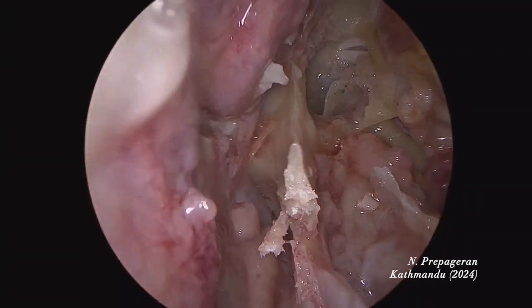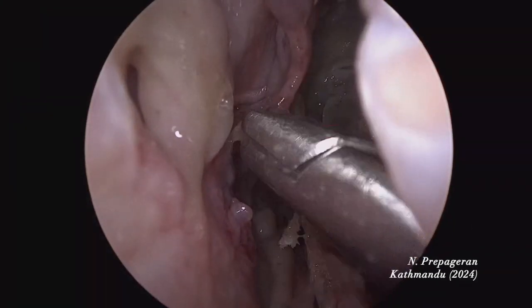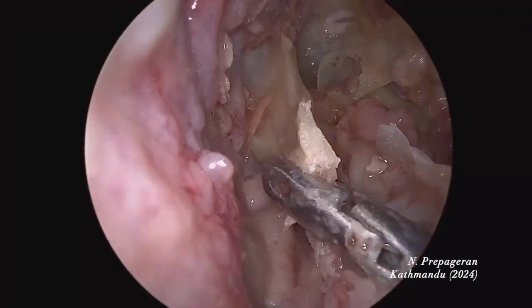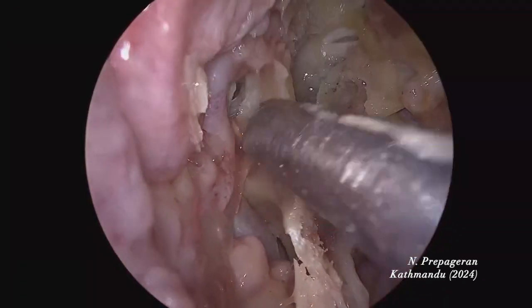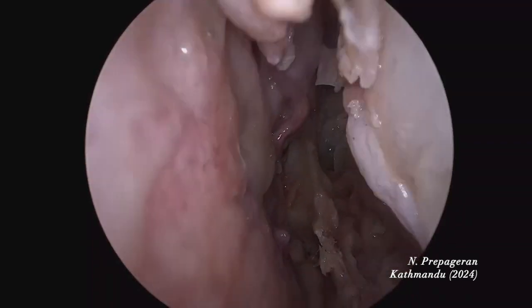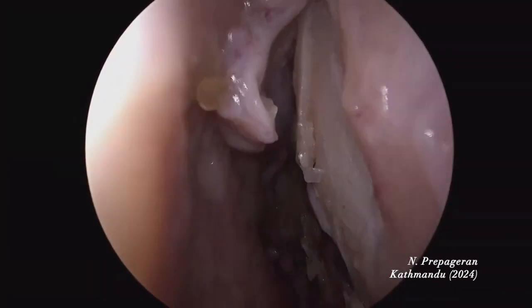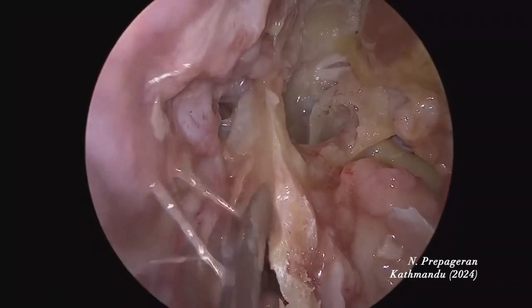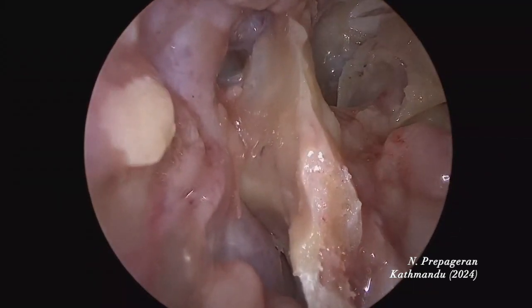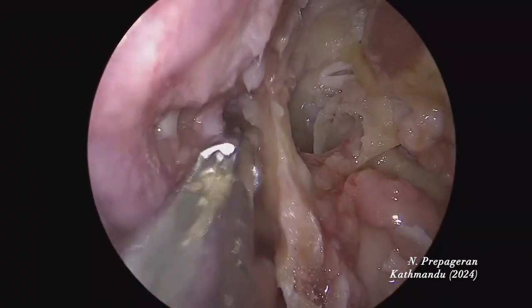The keel is exposed. On this side I've preserved everything — turbinates are intact, uncinate, bulla, everything is intact. I'm going to remove the keel. For septoplasty, you can remove the keel as long as you preserve the superior strut of bone and the anterior bone. This is the keel of the sphenoid — it looks like the keel of a ship. Follow and open the keel, biting all the way down on both sides.